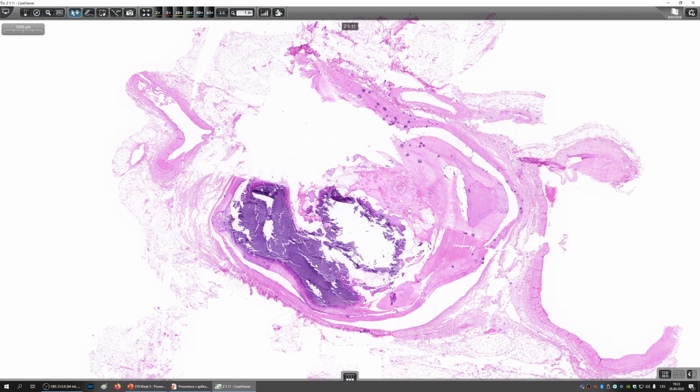But here the good thing is that these plaques develop quite slowly. So this probably has taken years to plug up the lumen, not just a few days as the previous one, or maybe a few minutes if there was big bleeding into it. So these plaques develop much more slowly, and this means that the organism has a chance to build up collaterals. So if you're really lucky and you have a completely clogged up vessel, but you have managed to develop the collaterals, then you don't have to essentially suffer critical ischemia of that limb. So the dynamics, the rapidness of the closure of the arterial lumen is also very important.